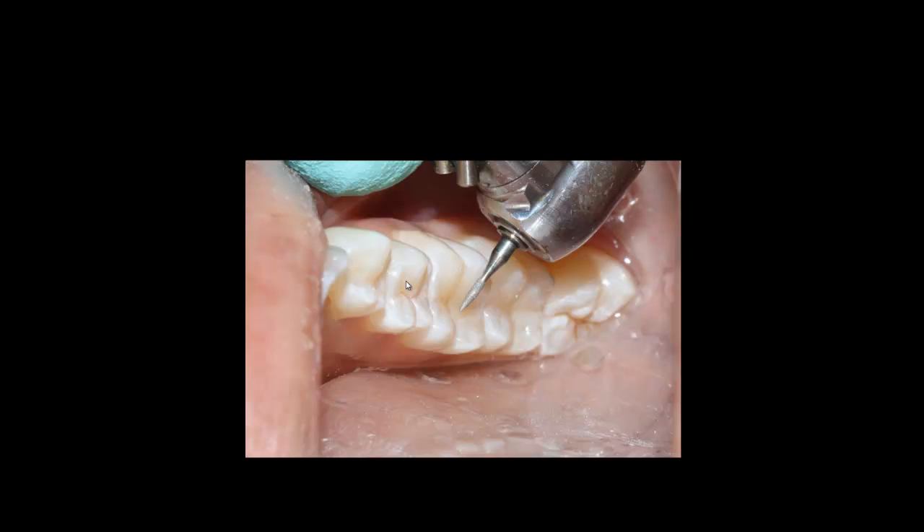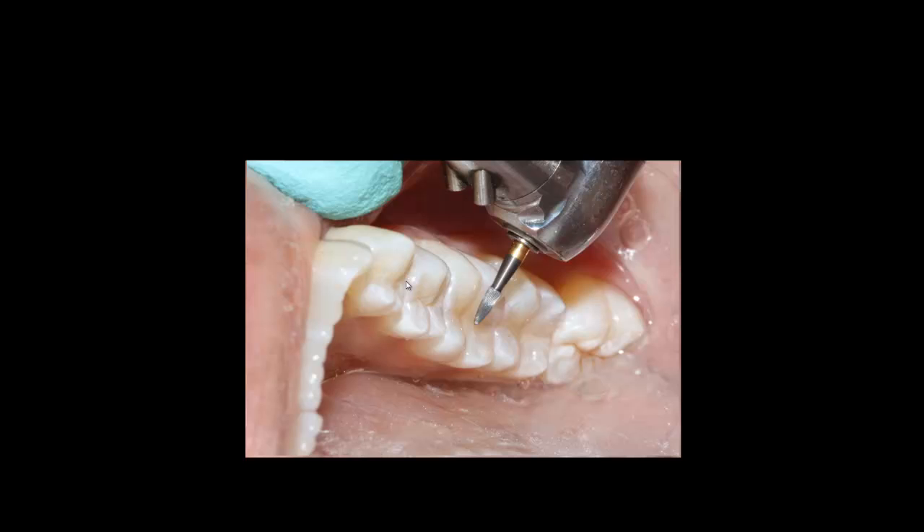For polishing, I use fine diamonds from Strauss Diamonds — diamond number 860/01 fine — at around 20,000 RPM to carve in the characteristics and remove any unnecessary tooth structure. Once that step is done, I use an ET carbide bur by Brasseler to eliminate all excess composite material from the occlusal surfaces.